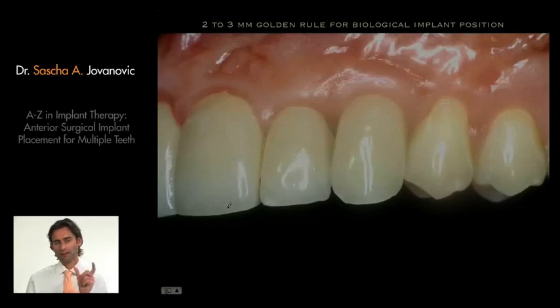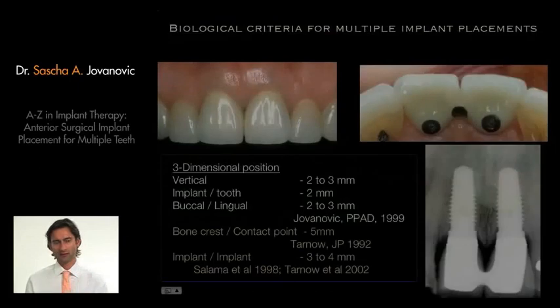So how do we compare the single teeth and the multiple teeth? Well, it's right here. And I'm going to be concentrating on this level here. You're looking at one area which is particularly difficult for multiple teeth. And that is to focus on the bone which is apparent between two implants, right here.